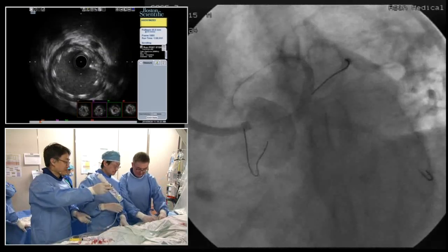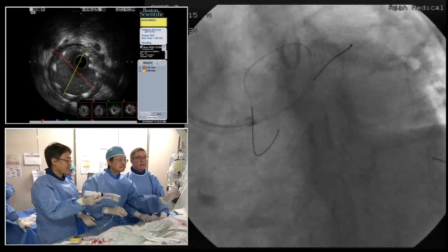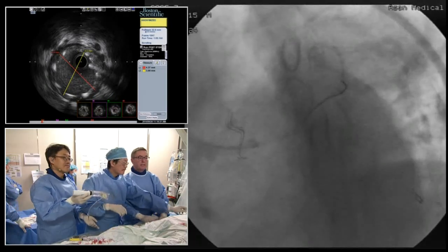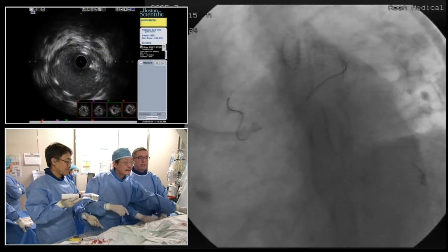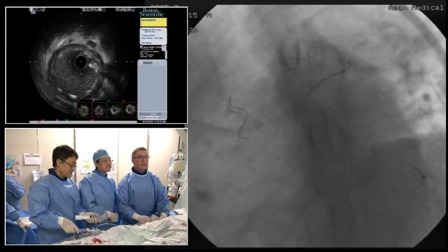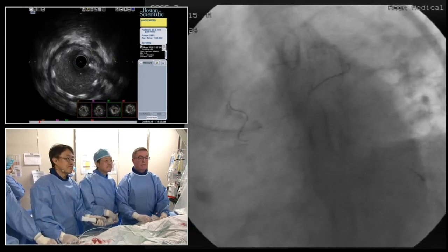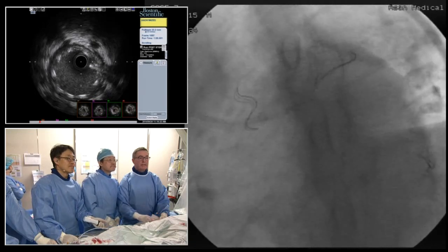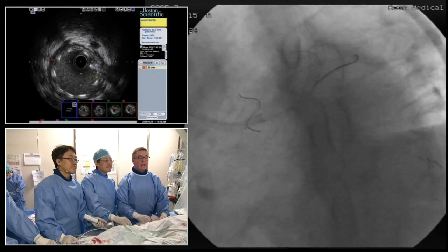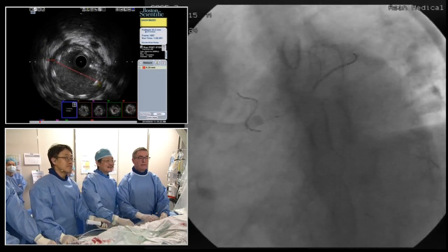Yeah, if we had a 4.25 by 6, you could get a very nice result doing that. But what I definitely want to do is stay away from the diagonal now. That's the trick. Don't worry about the guide really. It's a straight run and we're just sitting there. We've got 3 wires anchoring the whole system, and I don't want to trash up the proximal end of the stent, and I want the easiest ride into the left main possible. So it's pretty coaxial. It's not scary at all. Really good. So, there you go.